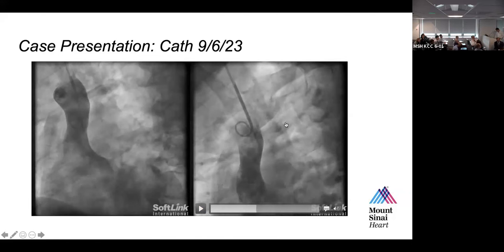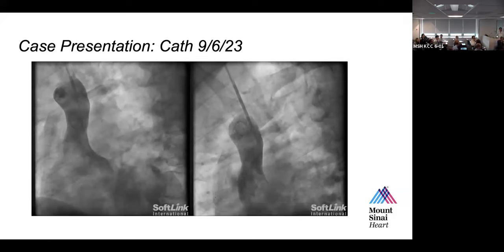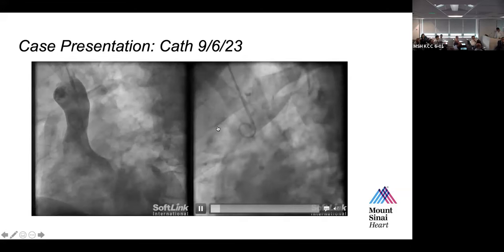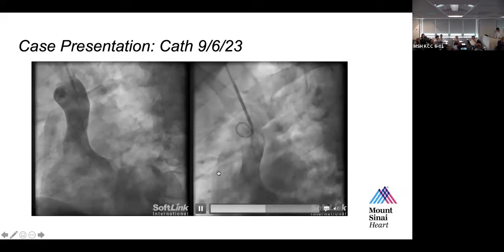And when it becomes a little bit further down, don't leave it exactly where it is. A little bit further down, take your little mouse, a little bit left, a little bit left, go outside. You can see from there, you can imagine there is some whiteness in between the darkness of the SVC, let's say. The SVC is not as dark as it's supposed to be up top. If you replay now and focus in this area between 7 and 9 p.m., you can see that there's some dynamic whiteness coming in that darkness. Unopacified blood.